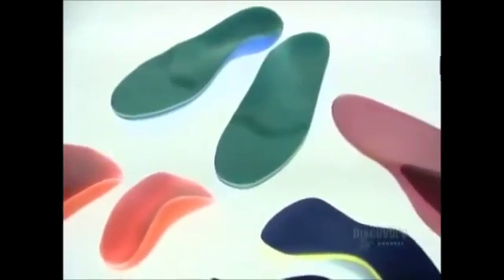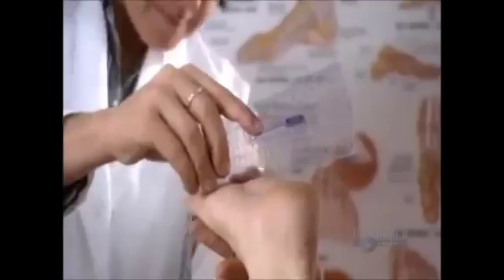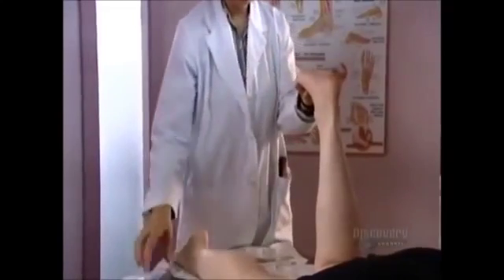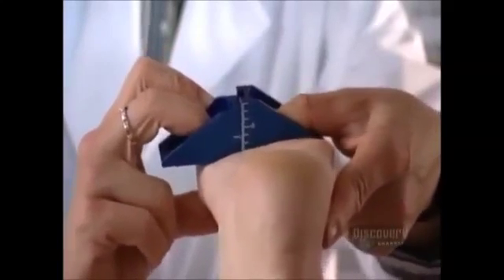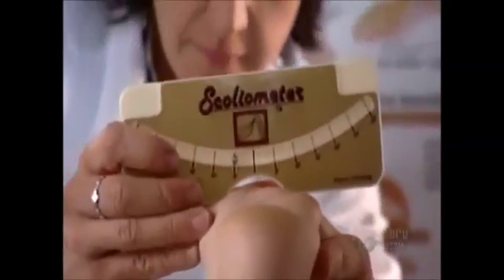Producing a custom-made orthosis starts with a thorough examination. A certified professional called an orthotist analyzes the problem area. In the case of this patient, the feet. After a few manual manipulations to test the range of motion and pinpoint weakness or pain, the orthotist uses various instruments to measure the angles of the different parts of the feet.